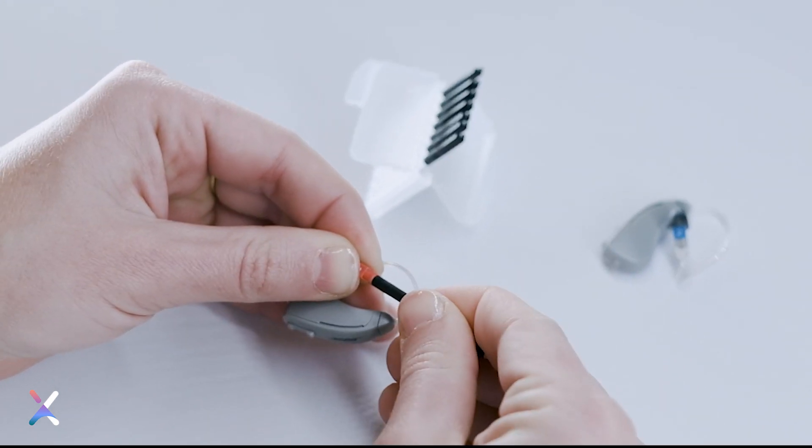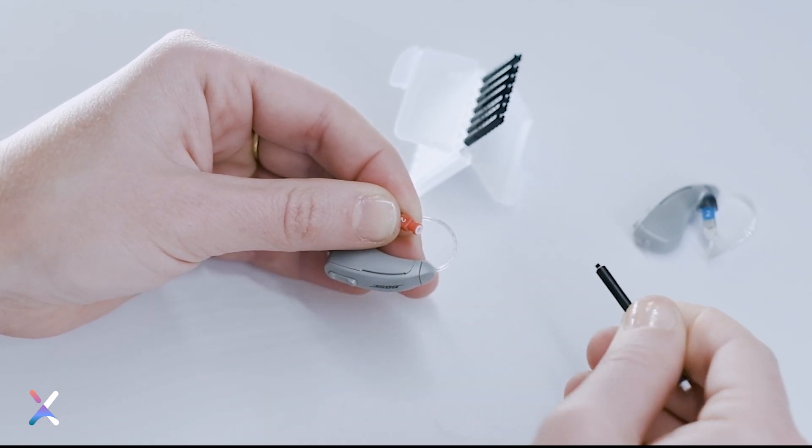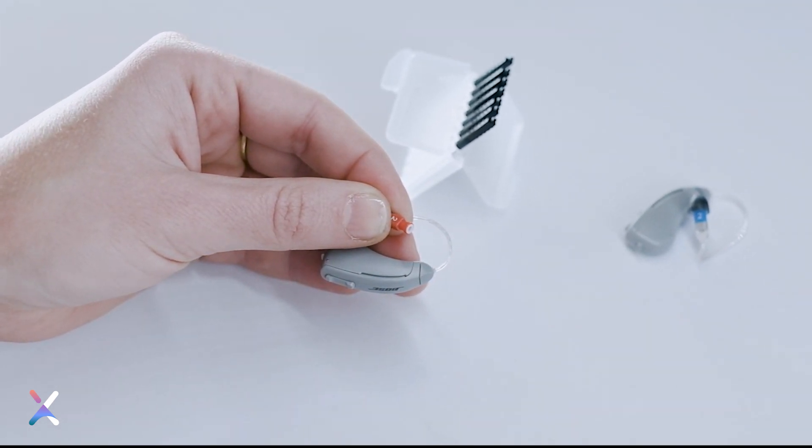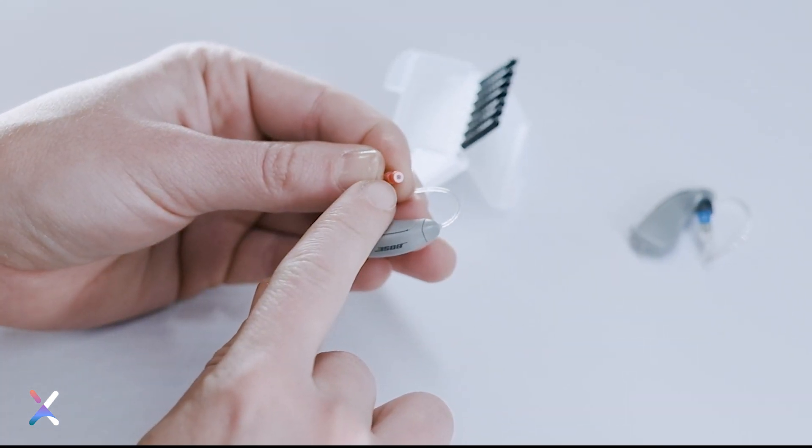Guide the new wax guard into the receiver so that it's flush with the top of the receiver. Then pull the tool straight out. Make sure the wax guard sits flush against the receiver.